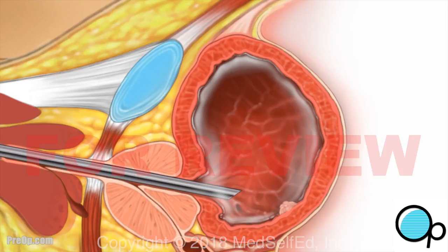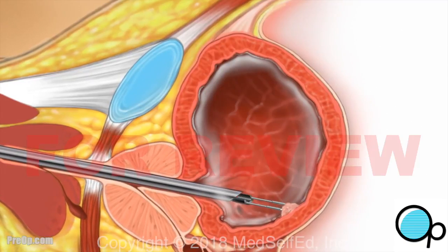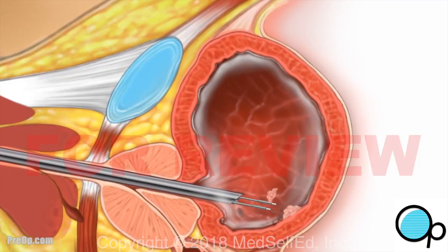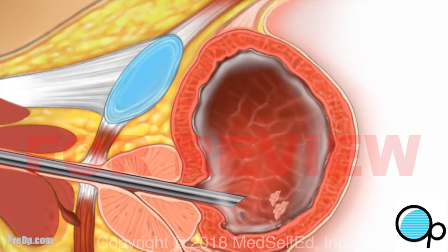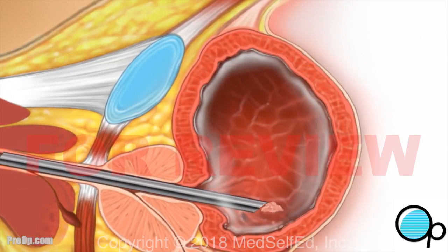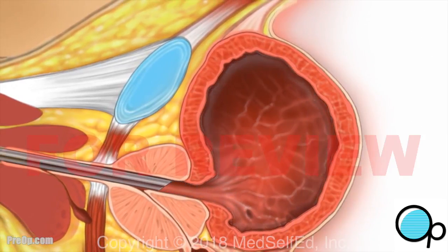Using the fiber optic light and camera lens of the scope to see, your surgeon will look carefully at the walls of your bladder. The tumor is cut away from the bladder in small pieces using the loop. Your surgeon uses suction to carefully remove those pieces from the bladder. The loop is also used to stop any bleeding that is seen. After the surgeon makes a final inspection of the bladder, the scope is removed.